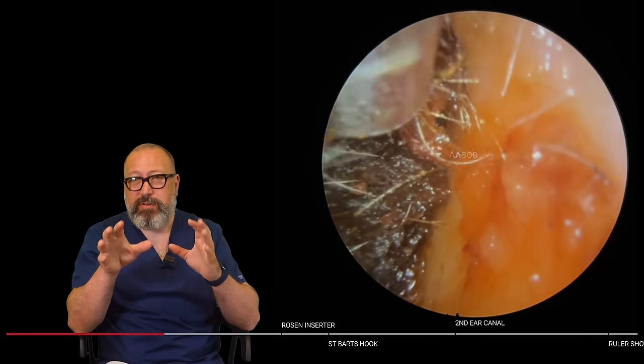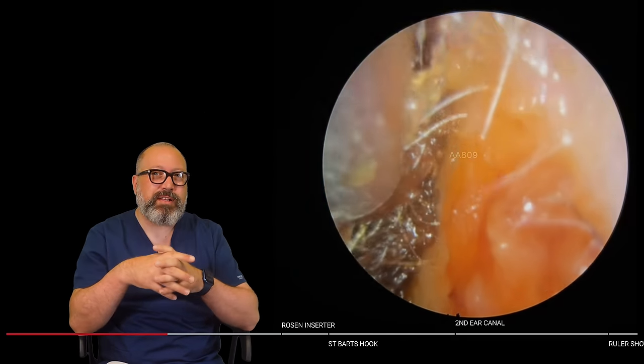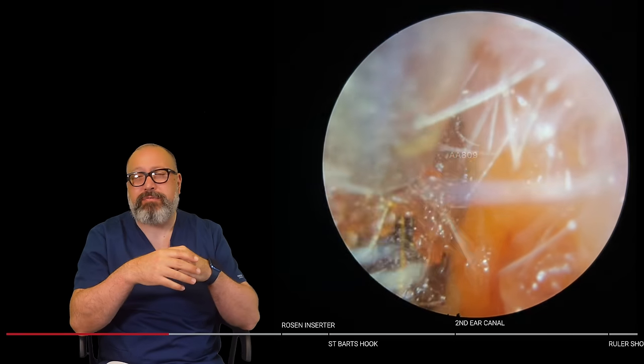So we've got this plug that's too big. We're breaking this down now at the entrance to the canal just to try and make it small enough to be able to get it out.